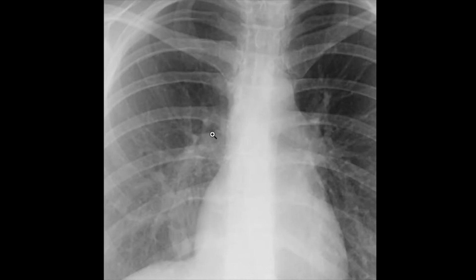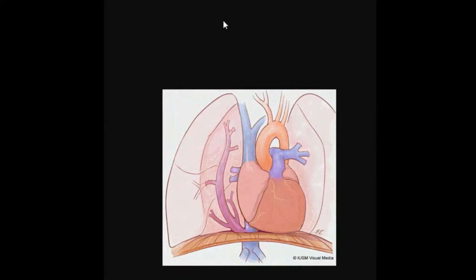Again, some imagination here. It sort of has that curvature and looks like a scimitar sword, and this is pathognomonic in scimitar syndrome, which is also known as hypogenetic lung syndrome, and this is just a cartoon representation. You can see this large pulmonary vein. Instead of returning to the heart, it returns to the inferior vena cava.